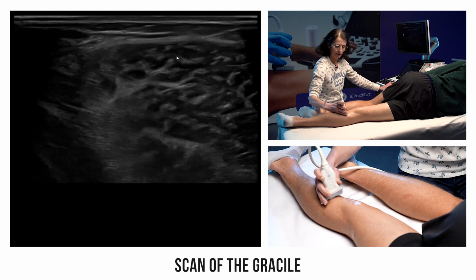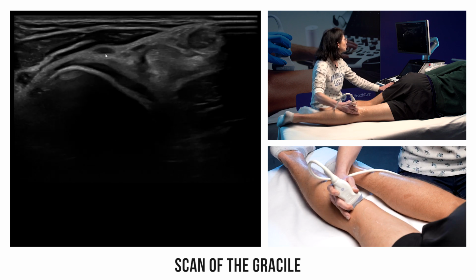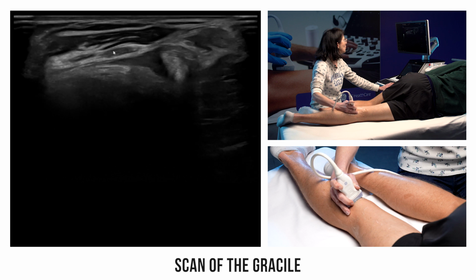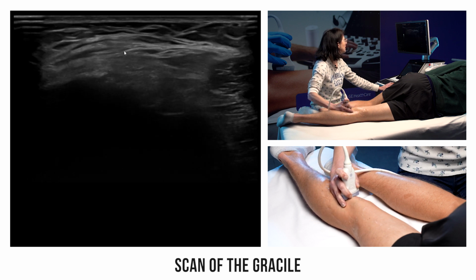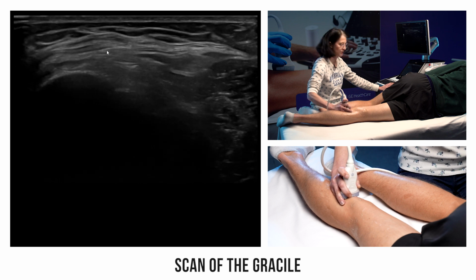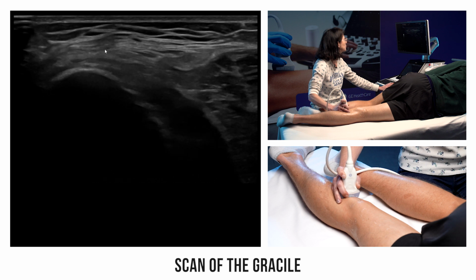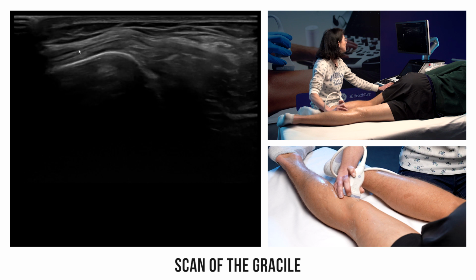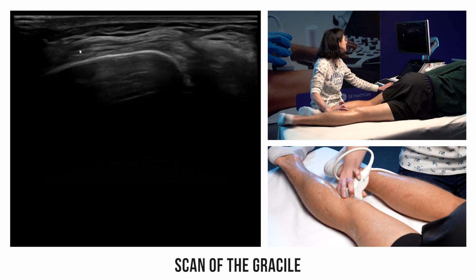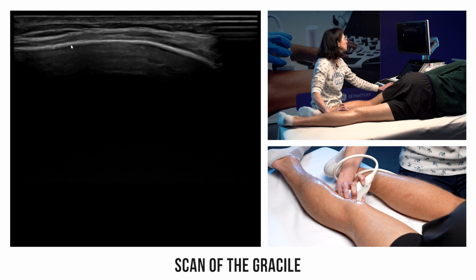If I bring the probe back to the popliteal fossa, we can identify the gracilis tendon again here. I follow along the gracilis in its short axis, and there again, the orientation changes. Oops, it's my probe that's not exactly in the correct plane. Here is the gracilis tendon in its short axis. We go down, down towards the front, and here are the fibers, which became horizontal and will insert themselves in the front, again on the anteromedial cortex of the tibia.